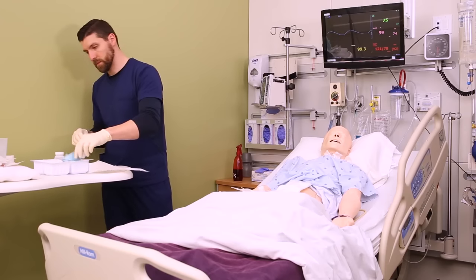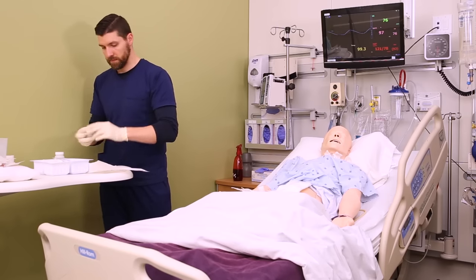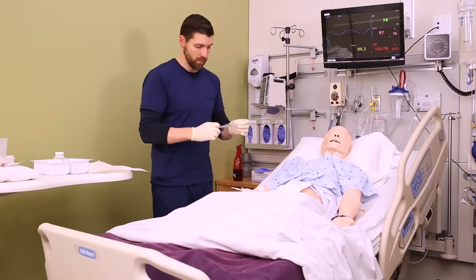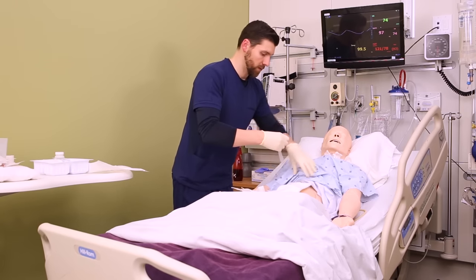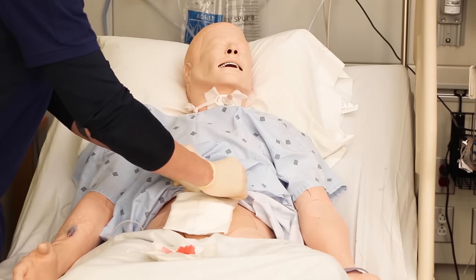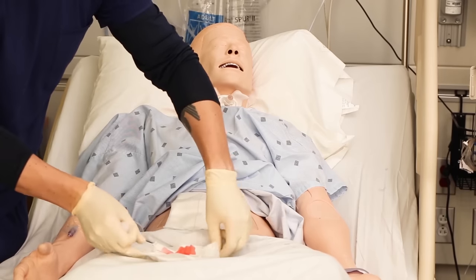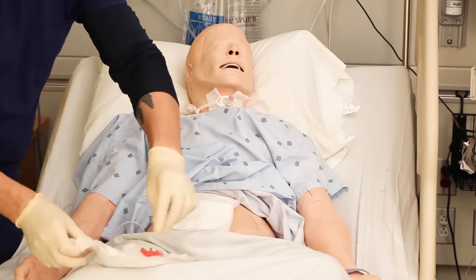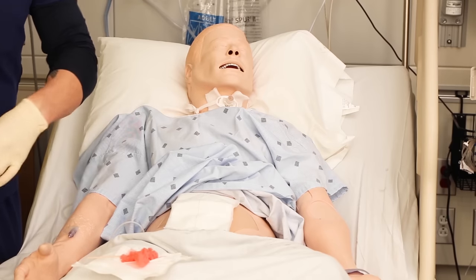Every dressing is different — make sure you know what your orders are. In this case, we'll take tape and secure all four sides of the ABD pad. We're using one inch tape here, which is perfectly acceptable. Personally, I love three-inch wide silk tape — I think it sticks better, gives better coverage on the dressing, and is more convenient.